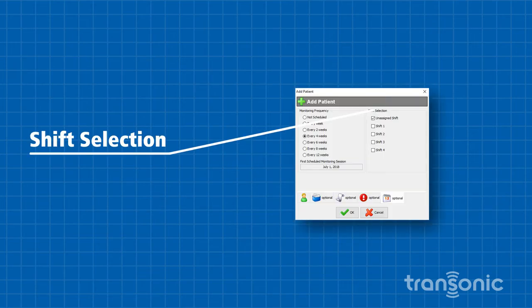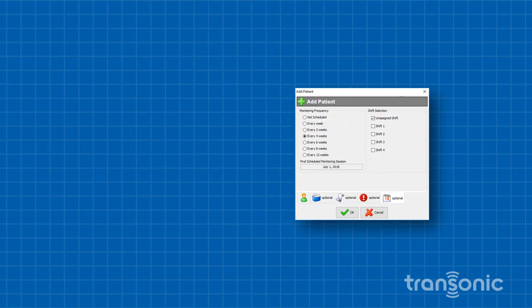Under Shift Selection, click the checkbox that corresponds to the shift during which the patient will arrive. For example, Shift 2.